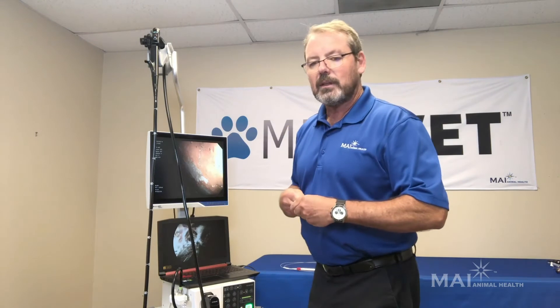The 8 millimeter scope is 150 centimeters in length, which allows you to work with everything from a cat all the way up to the large breed dog. We think that our endoscope is a must-have because it allows the practitioner to achieve a higher level of medicine.